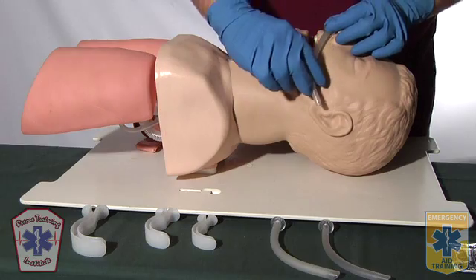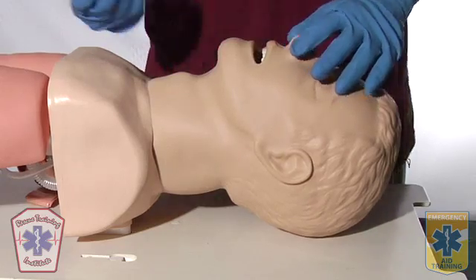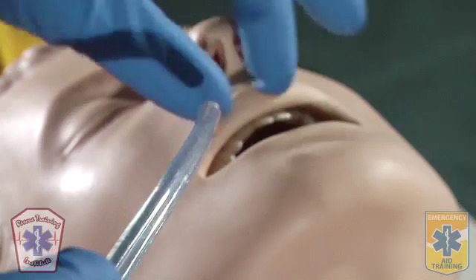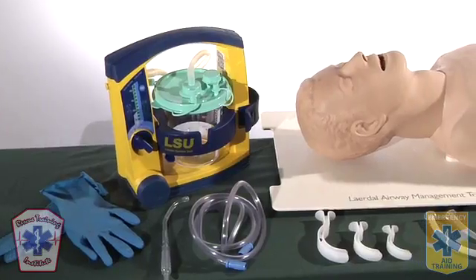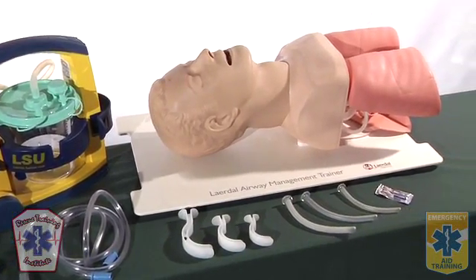This station is designed to test your ability to properly measure, insert, and remove an oropharyngeal and nasopharyngeal airway, as well as suction a patient's upper airway. This is an isolated skills test comprised of three separate skills. You may use any equipment available in this room. You have five minutes to complete this station. Do you have any questions? No.